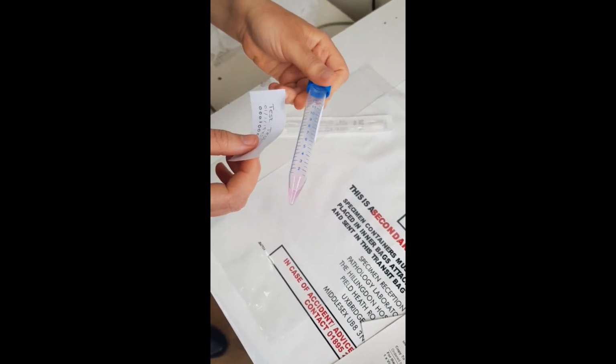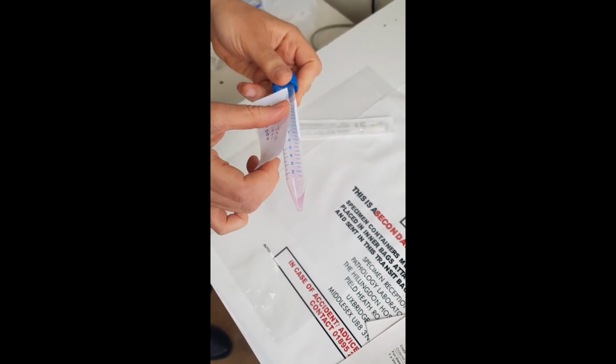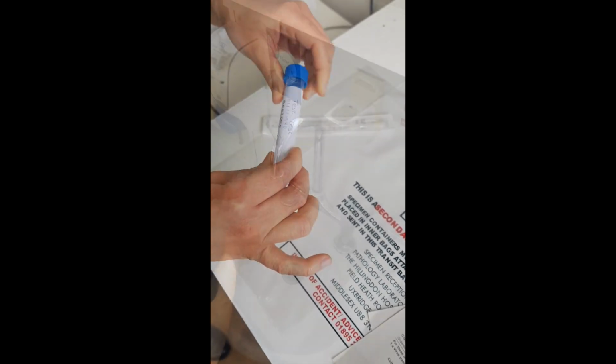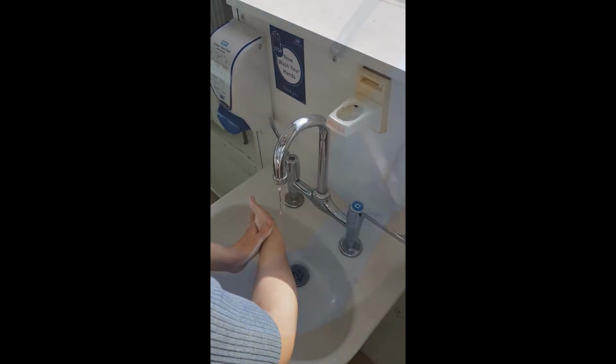Label the container with a patient addressograph. This is a critical step, and many samples have been rejected due to poor labelling. Wash your hands thoroughly and put on PPE.